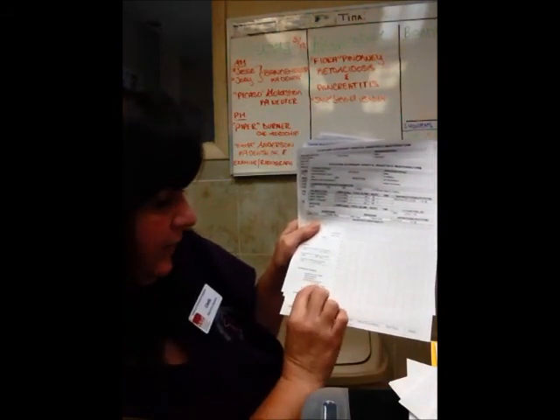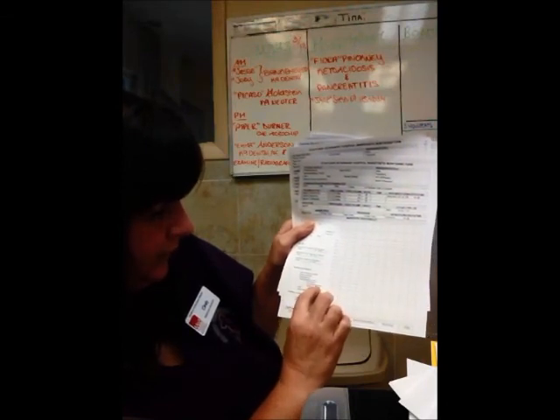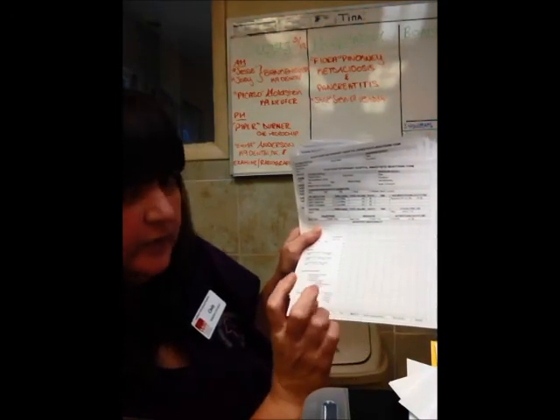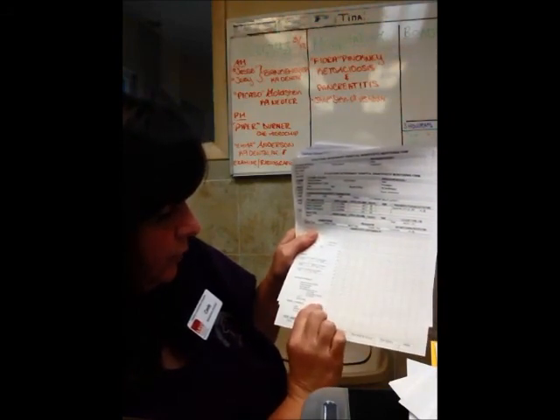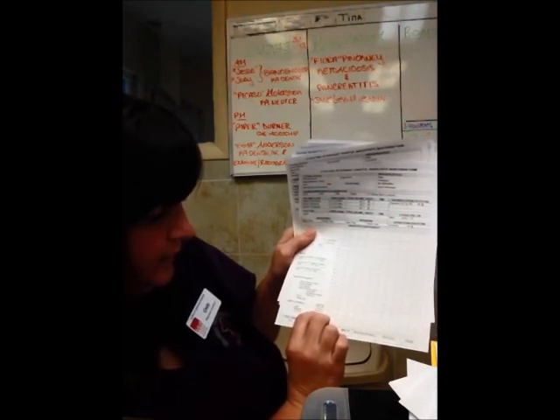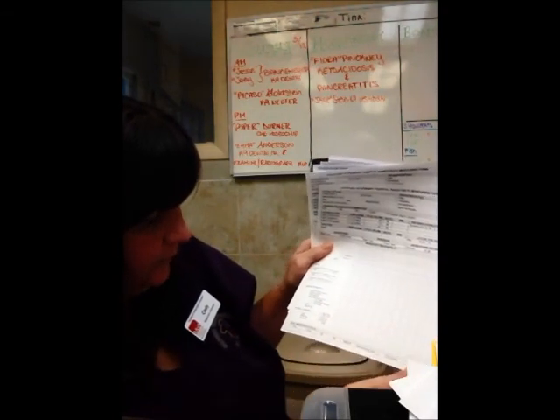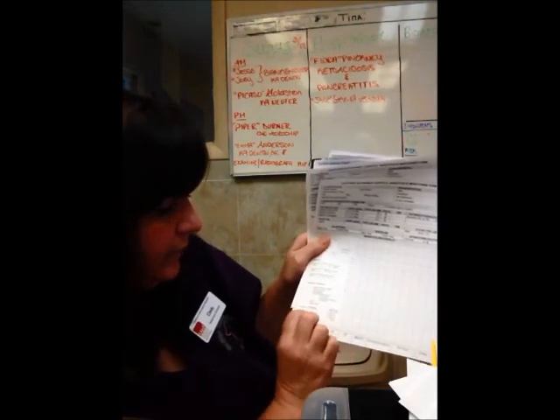They'll either be on the OR table for the warming device, or they'll be using the Chilly Buster blanket. We have an IV warmer that we use in either place, EKG, and our Breathsafe, which hooks up onto the E-tube as well. And then here are all the codes for the heart rate, respiratory rate, SpO2, mean blood pressure, EtCO2, and temperature, and the quality of their sedation. So while they're being monitored, at the end you'll note whether they were overall light, moderate, or profound.